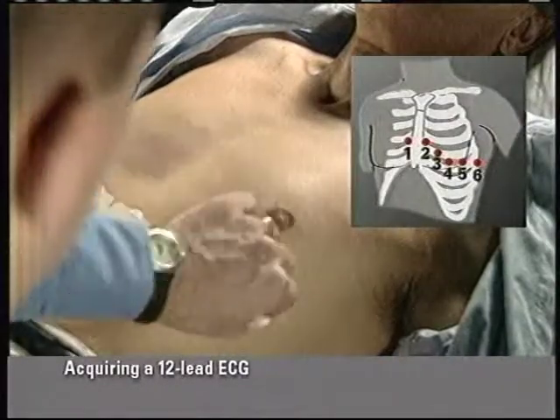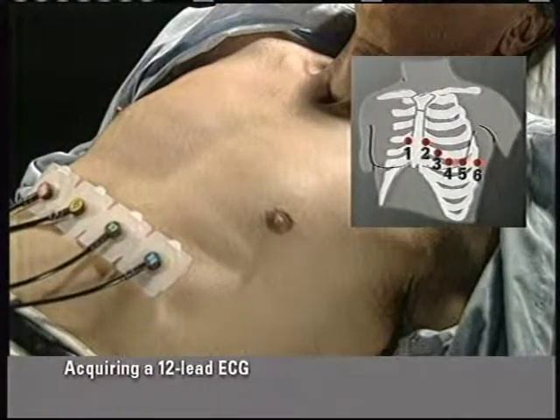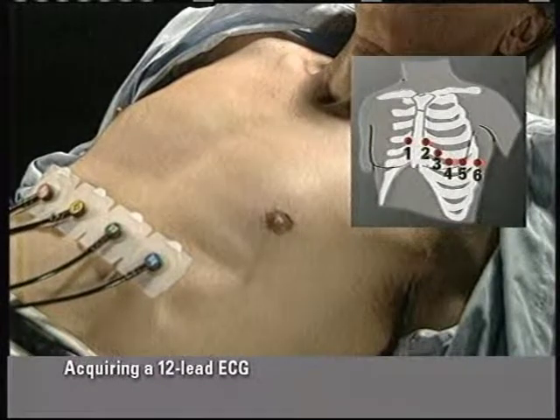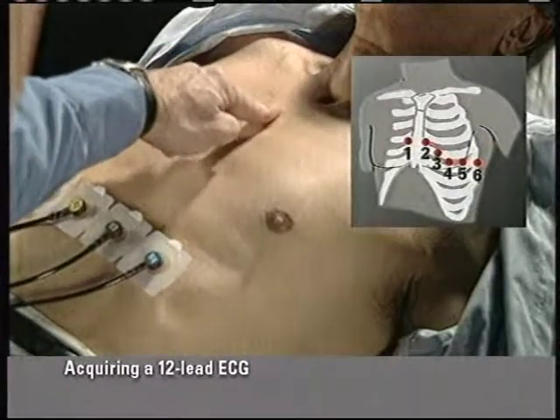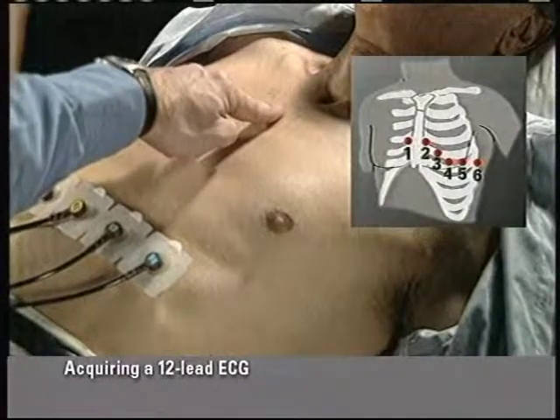The electrode placement for precordial lead 1 is in the 4th intercostal space to the right of the sternum. To locate this position, place your index finger in the notch at the top of the sternum. Move your finger down the sternum until you feel an elevation or thickening of the bone. This is the angle of Louis, where the manubrium joins the body of the sternum.